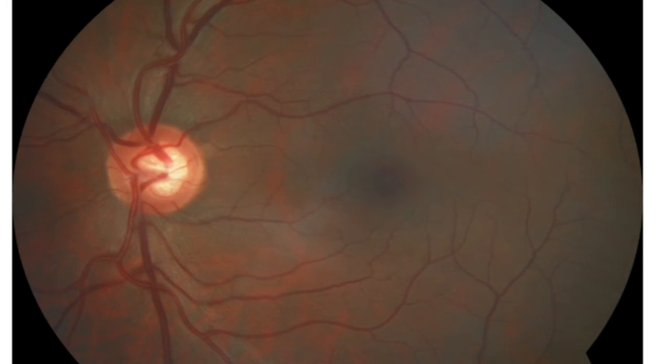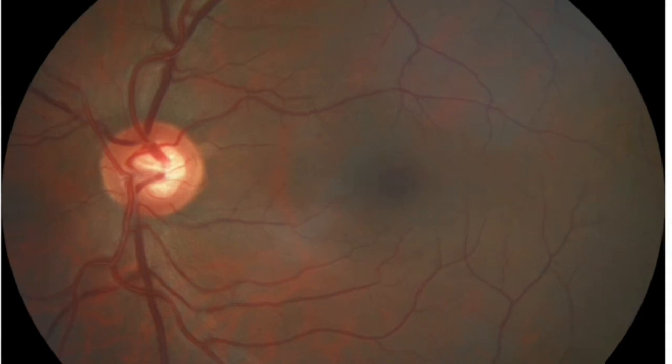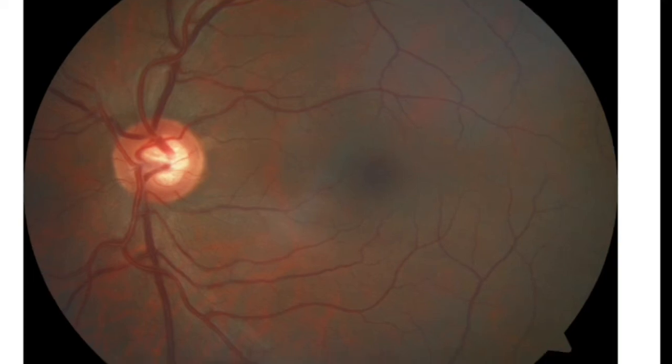That is, a large optic disc will usually have a macrocup or large cup, but it can also be a physiologically large cup, and even myopic degeneration patients and glaucomatous atrophy patients will also have a large cup. Whereas the size of the optic cup is very small in a small disc. It looks as if there is no cup at all in the case of a small disc. That's why it is very important to measure the optic disc size, because a very small cup of even 0.2 to 0.3 may be very significant in a small disc. That may indicate that the patient has glaucoma, but it may not be significant when the optic disc size itself is large.